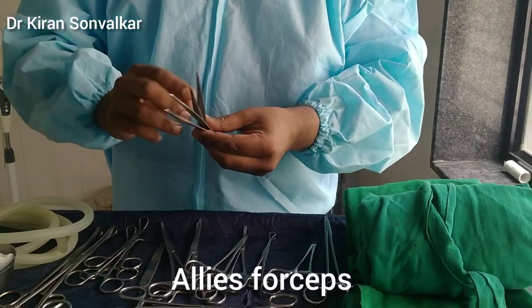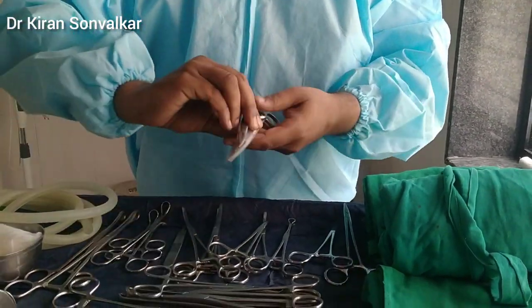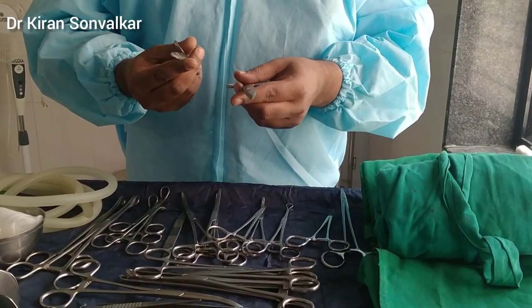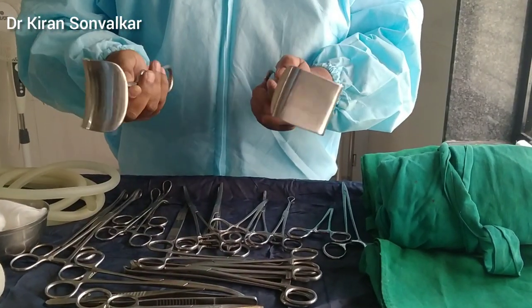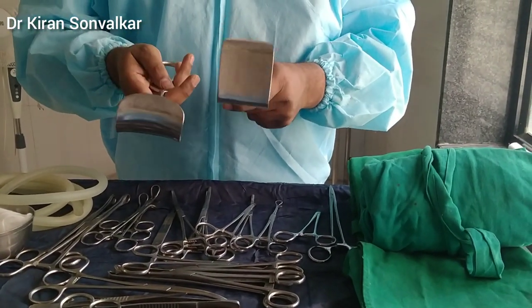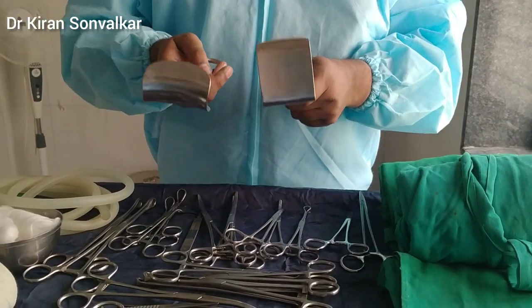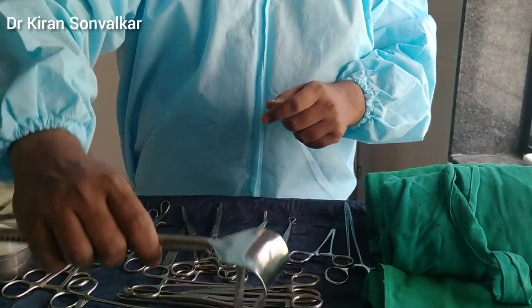These are two tooth forceps. These are scissors, one for cutting, and this is Doyen's. Doyen's is used for retracting the bladder. It prevents the bladder from coming up during incision and suturing.